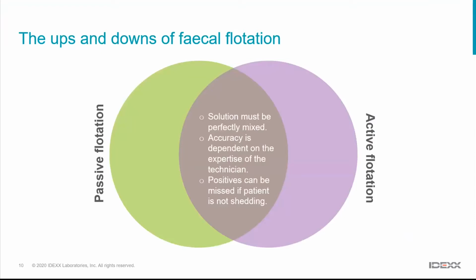It's trying to increase the sensitivity of the technique, to give us better results. So, the advantage of the in-house kits is they're very inexpensive, but we get a better sensitivity by doing the technique in the laboratory.